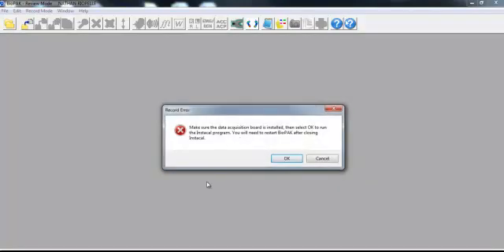And then this is the message that a lot of you will see. It'll say, make sure that the data acquisition board is installed, then select OK to run the Instacal program.